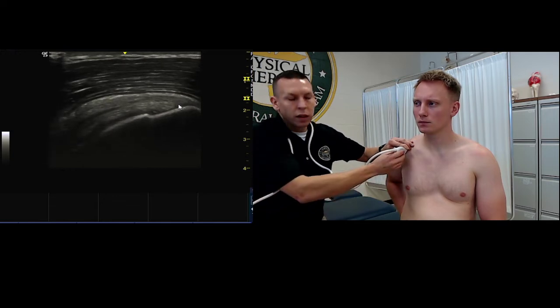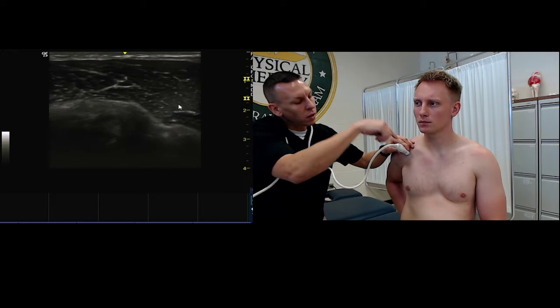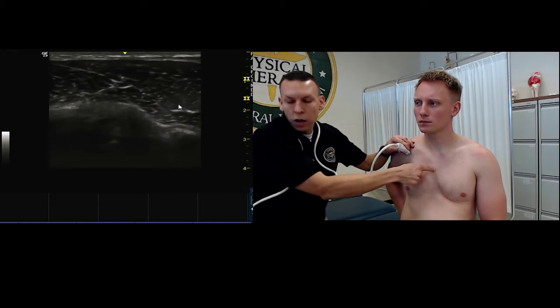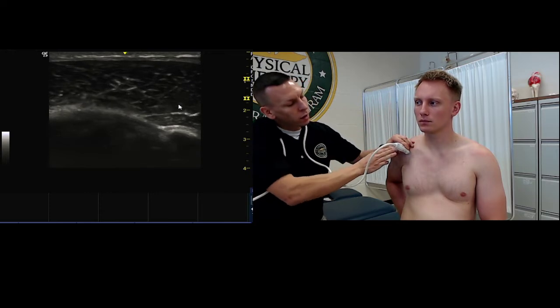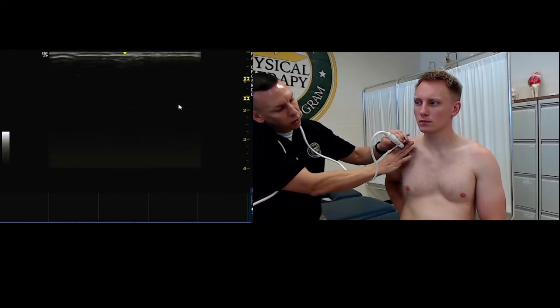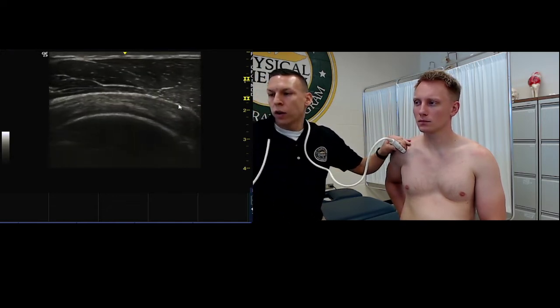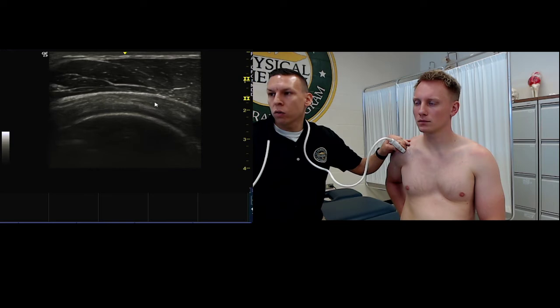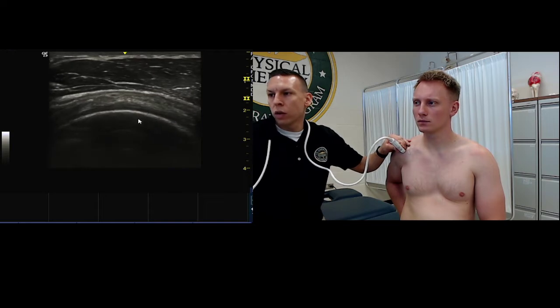After we've done that in long axis, we're going to take our probe and look at it in short axis. And here I like to think the probe is pointed towards kind of their sternum. And so now it's kind of targeted this way, because again, we're looking at it in short axis. So the tendon's going here, and we're putting our probe right on top of that. And so here's where we find this tire on the wheel. Again, here's the tire, the supraspinatus, and the wheel, here's the humerus.